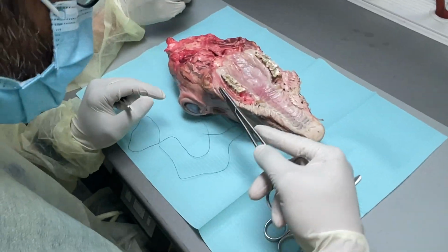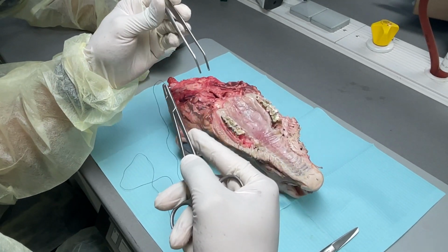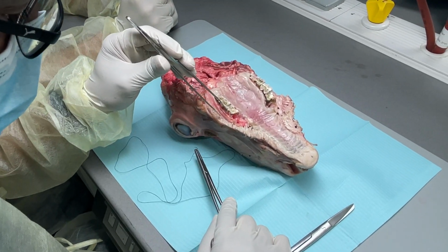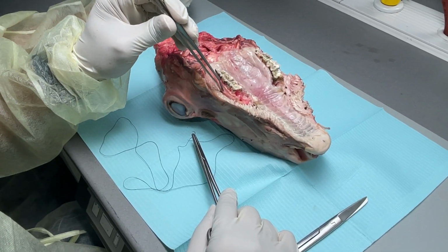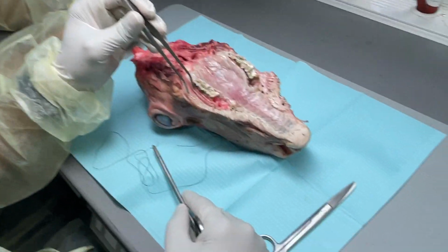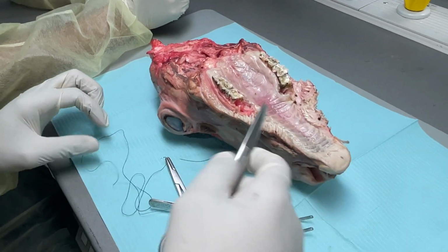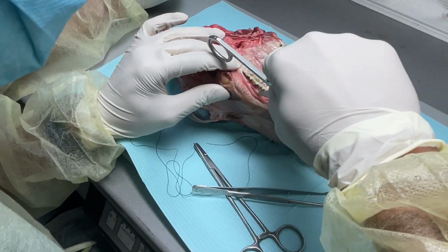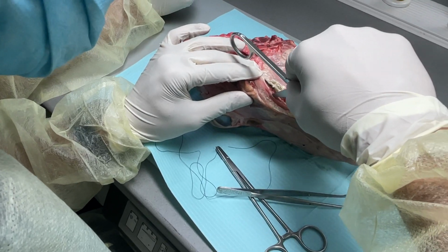Plus, let us see. Now this is what I said. You see the eye, so that it can easily pass through as a guide. So when you are holding the tissue, there is an opening downward. If I'm holding the tissue, it will guide me to pass it through. We can reflect it a little more, and then we can go deeper, so that we can pass the instrument deeper.